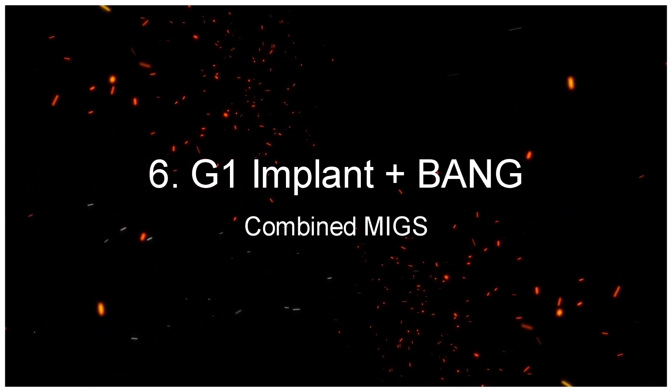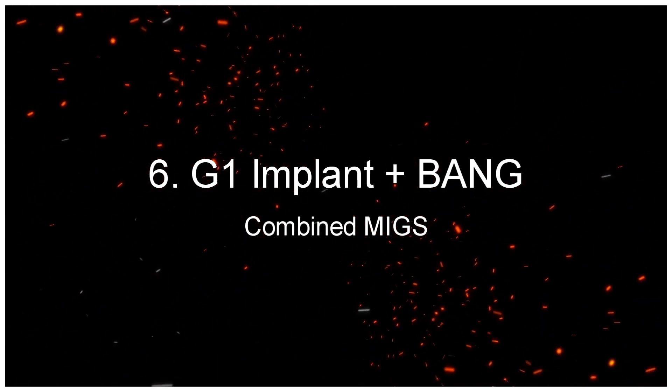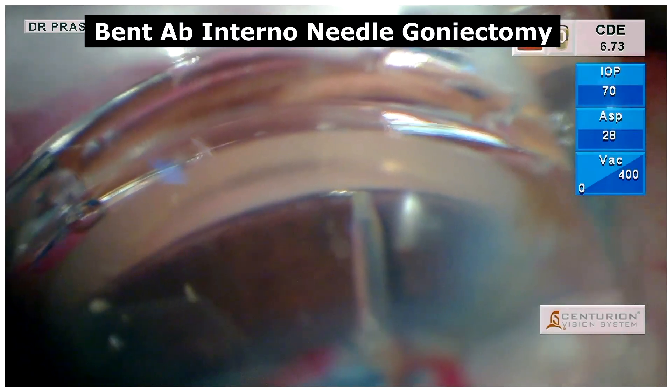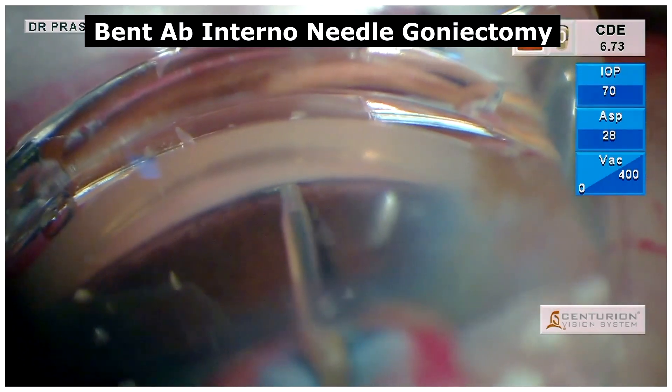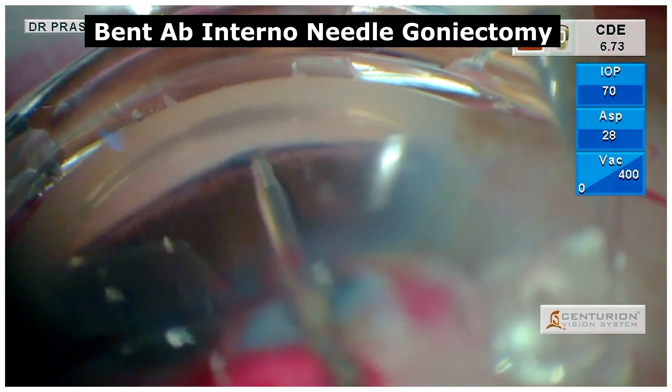The G1 implant plus BANG combined MIGS. Similarly, in this case, with the implantation of a G1 iStent, an additional MIGS procedure was done.